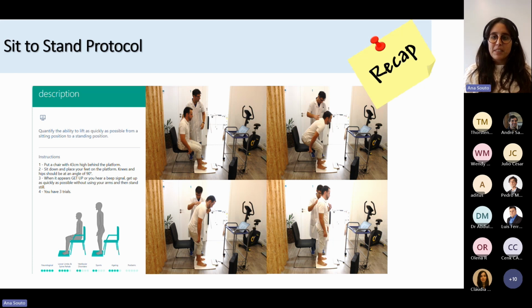As you can see in the picture, the plate is placed in front of the chair, and the software will give a command to get up, with a beep sound. The patient has to get up as quickly as possible without using his arms, okay? And then he has to stand still for a while until the software says he can rest, okay? This test has 3 trials, so he has to repeat the movement 3 times, okay?